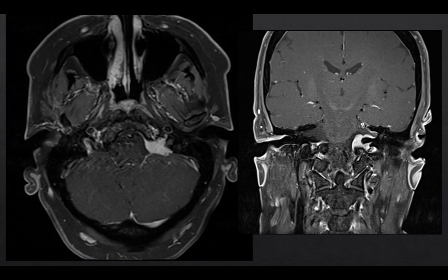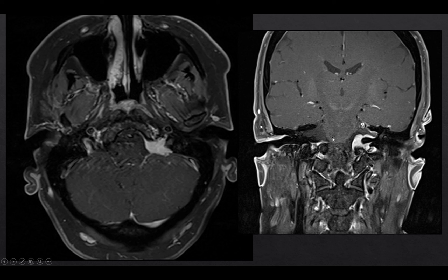Here we have our third major differential consideration for this location. On CT we would see a permeative sclerotic osseous change, which was not present in this case. We see a homogeneously enhancing mass centered in the left jugular foramen, but also involving the left internal auditory canal above it. It has a broad dural attachment and a small dural tail. This is most consistent with a meningioma.